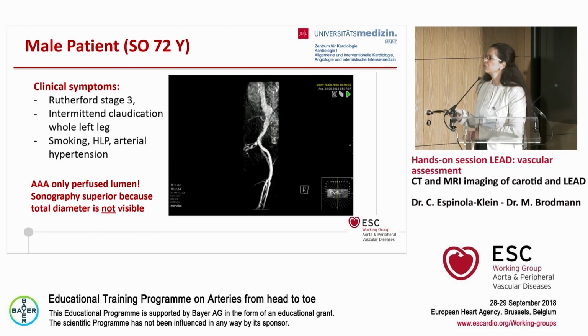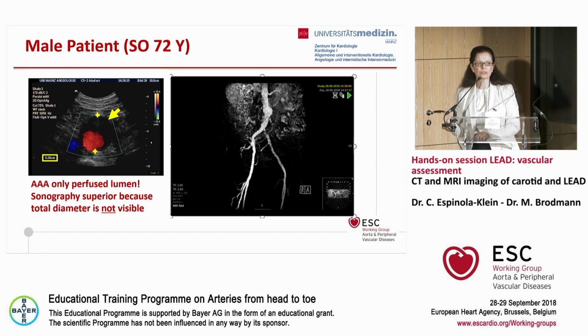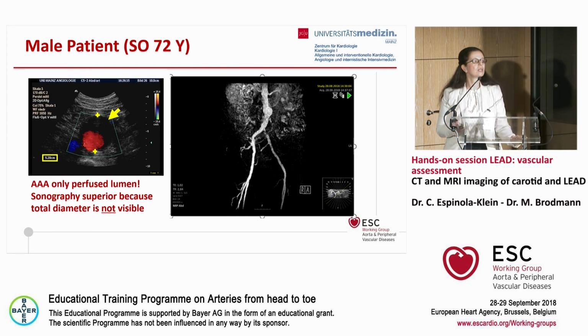You have first, from my point of view, to add an ultrasonographic evaluation. Of course, we had this before we performed the MRI, but just sometimes the patient brings his images with him. This is important. And in addition, maybe we can discuss, in this case, in fact, an additional CT scan, Marianne.